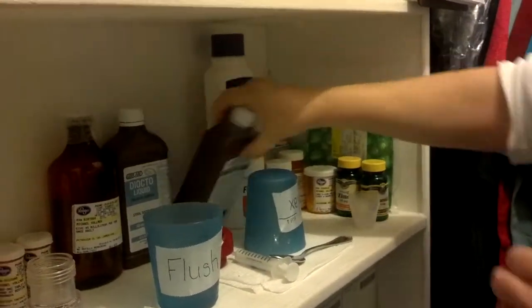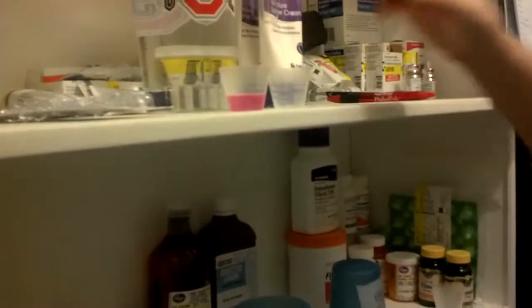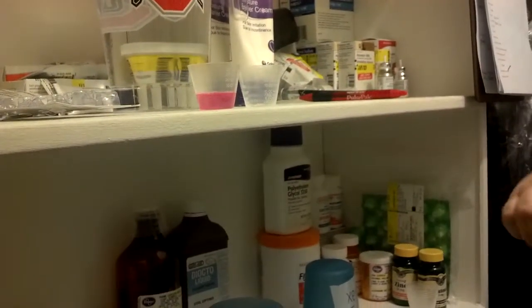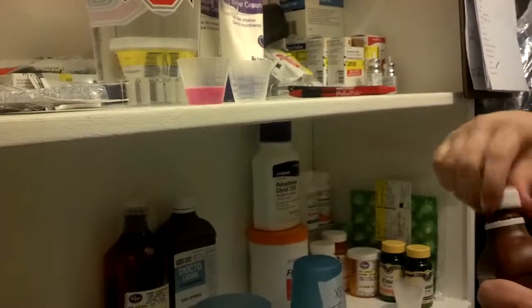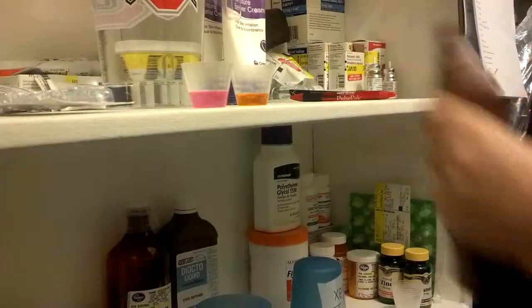Next one on the list is iron. You get 7.5. I shake it first. And again, it's at eye level now, so I'm just pouring to the 7.5 mark.